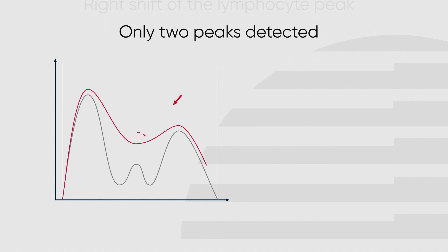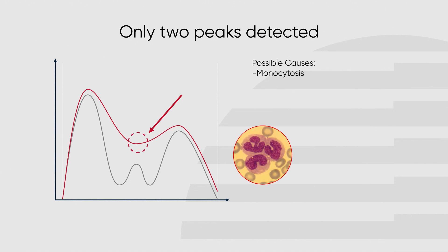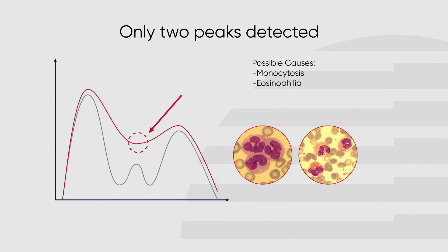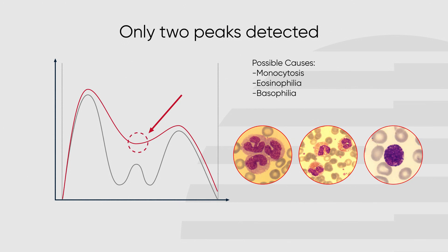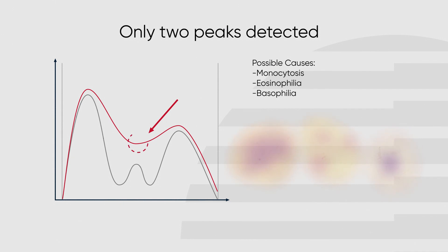An elevation in the midsection of the histogram could have several possible causes, such as monocytosis, eosinophilia, and basophilia. The high increase of mid cells causes the lymphocyte and granulocyte peaks to merge and the analyzer is unable to distinguish between the populations. If this occurs, the instrument may show an OM flag; proceed to confirm the abnormality in smear.